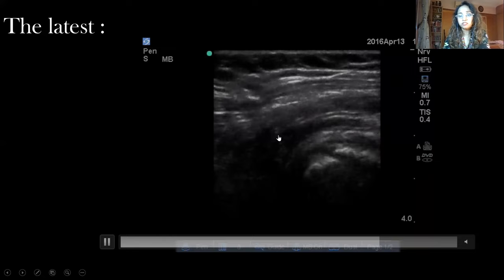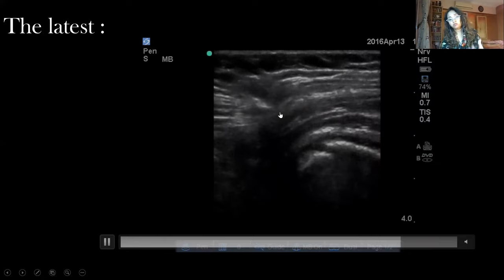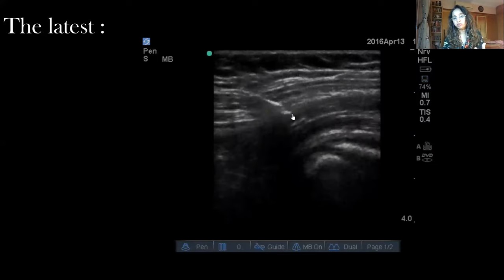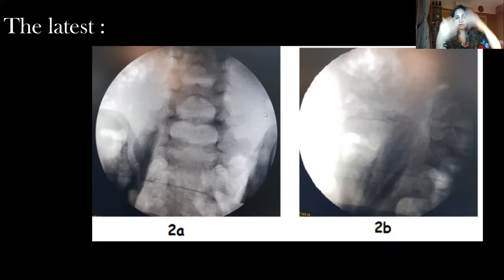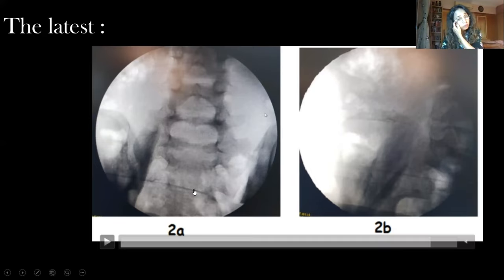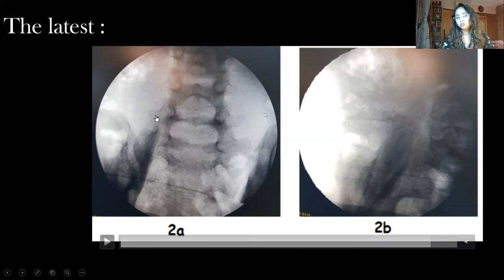This is the iliacus muscle as such, and the needle really walks in straight like this. We create a lot of space by injecting half the calculated volume. So for a 10 kilogram child, we use around 5 ml going first, open up the fascia iliaca, and then thread the catheter inside. In grown-up children, we have even injected dye. We've shown that it almost reaches till L4, and we haven't seen it going all throughout. But yes, it has demarcated the psoas at the lower border.